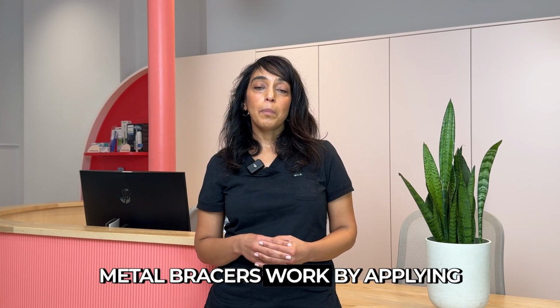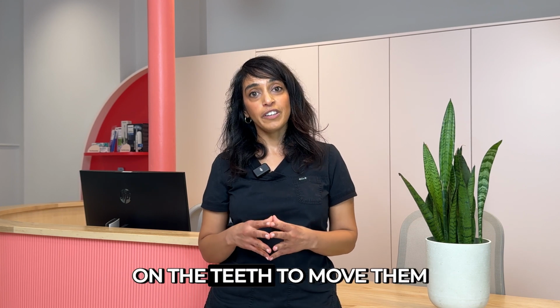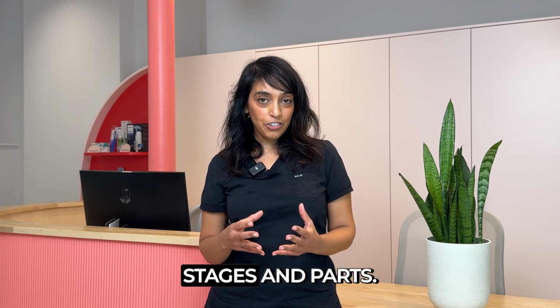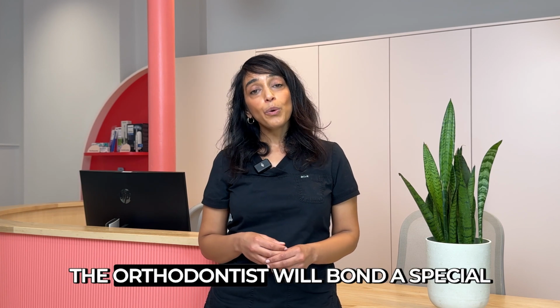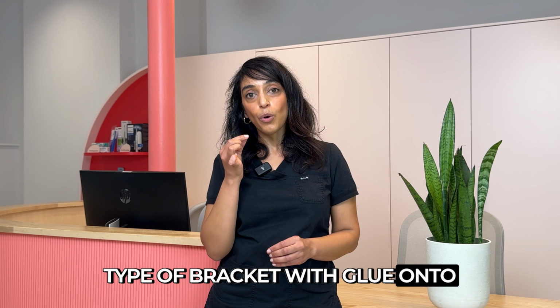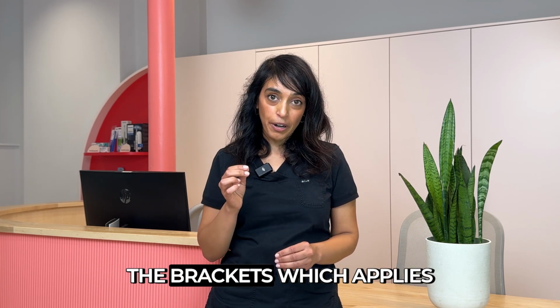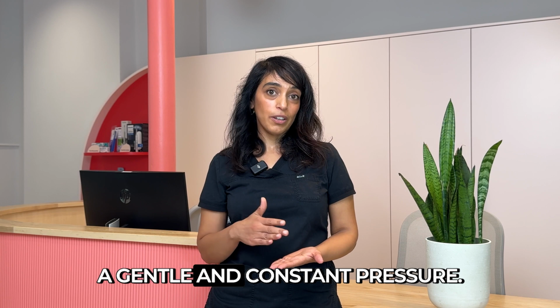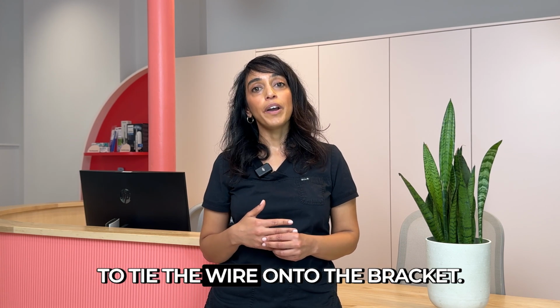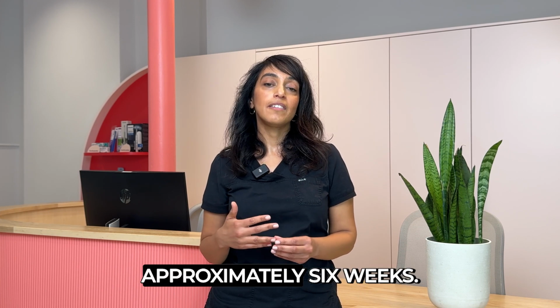Metal braces work by applying a gentle yet continuous force on the teeth to move them into the new position. This consists of multiple stages and parts. The orthodontist will bond a special type of bracket with glue onto the front surface of your teeth. A wire is then threaded through the brackets, which applies a gentle and constant pressure. Special elastic bands are used to tie the wire onto the bracket, with timely adjustments approximately every 6 weeks.